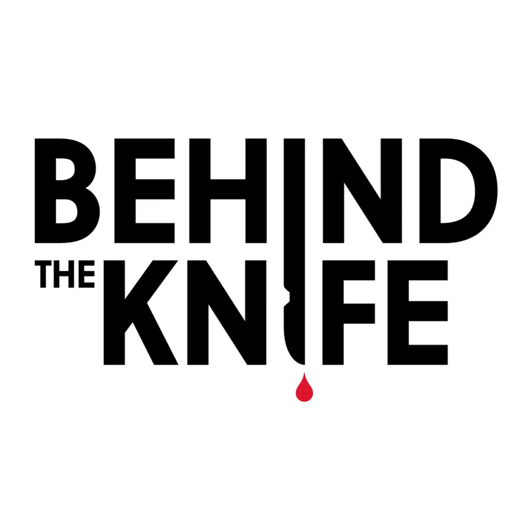However, I couldn't find any data to support that. So I think that in the case where you have a contaminated hernia, or for whatever reason you want to stage this repair, the patient isn't doing well, it's a contaminated case, you don't feel like you have the resources or expertise to deal with this hernia, I think in those cases doing a bridge repair with Vicryl mesh or biologic mesh, both are reasonable choices. But for doing an abdominal wall reconstruction, I don't in my practice use biologic mesh, but I know Rosen has a lot in the past.